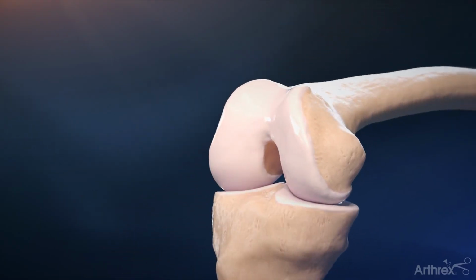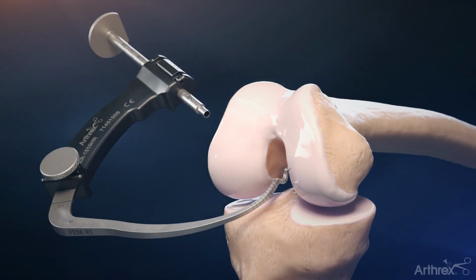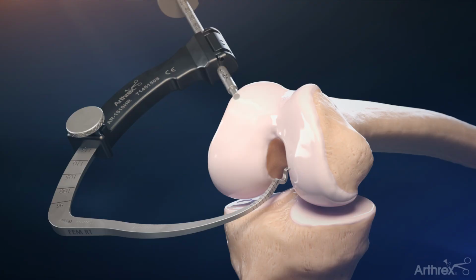Place the ACL femoral guide over the ACL femoral footprint arthroscopically. Adjust the angle of the guide to the desired position and tunnel trajectory, and then lock into place. Push the ratcheting drill sleeve down to bone. Advance a FlipCutter III drill pin through the ACL femoral footprint.